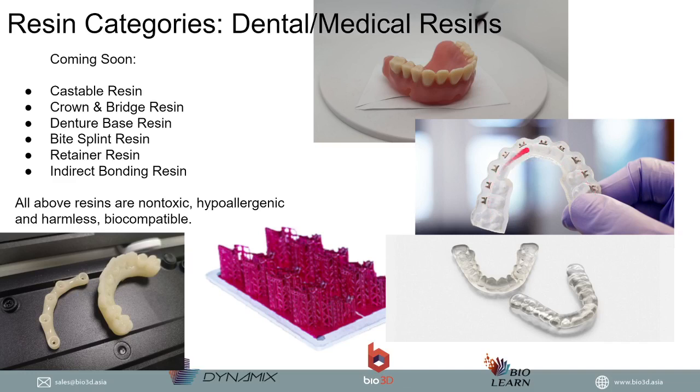And so basically this case was fully designed in CAD software, something similar to 3Shape's Ortho software. So the software knows exactly where you would like to place your brackets. From that, it creates a shell that has a little pouch for where the bracket should go, and then you apply a little bit of light cure bonding or light cure resin, your standard dental light cure resin, the same resin you'd use for bonding brackets in normal situations. And you would then in one go actually be able to set all of those brackets in the patient's arch at once.